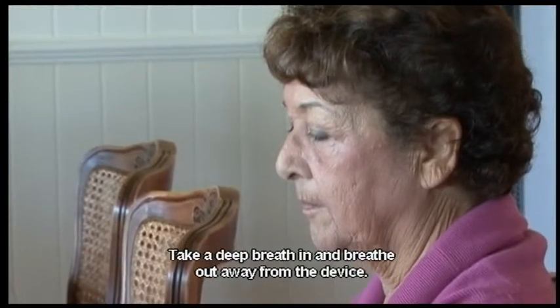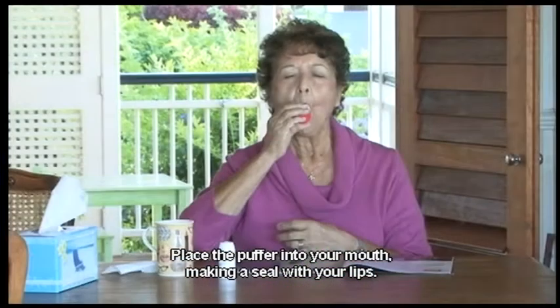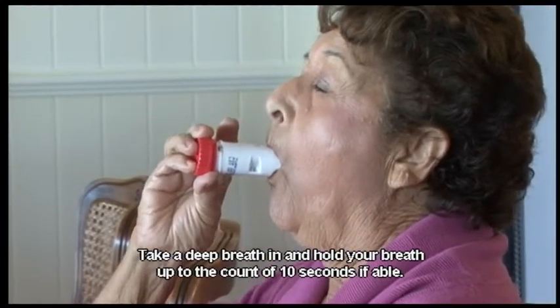Take a deep breath in and breathe out away from the device. Place the puffer into your mouth, making a seal with your lips. Take a deep breath in and hold your breath up to the count of 10 seconds if able.